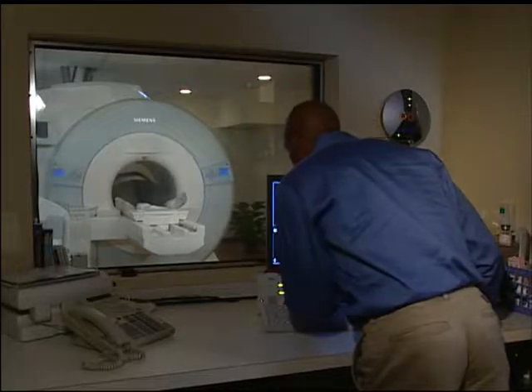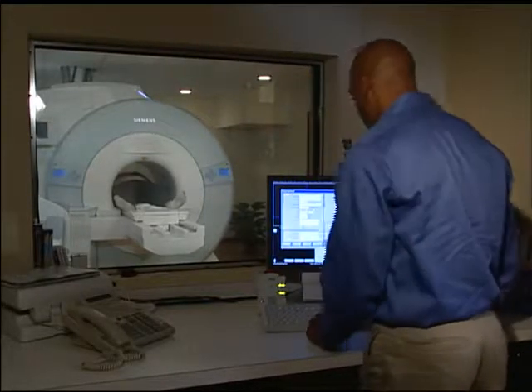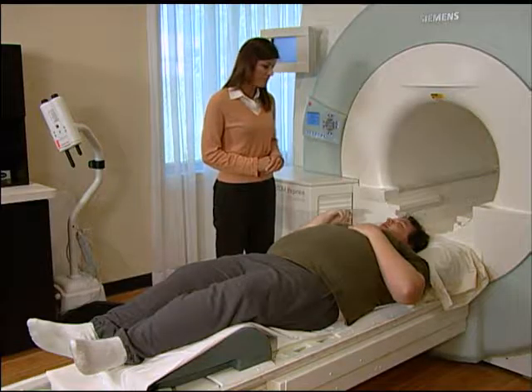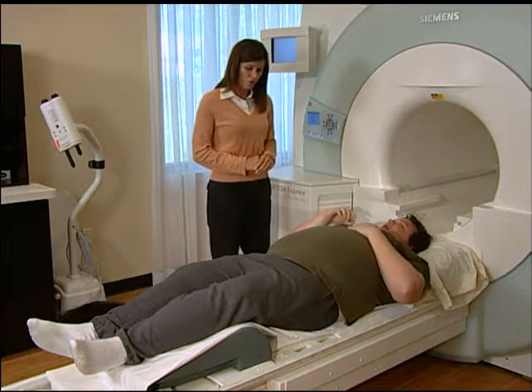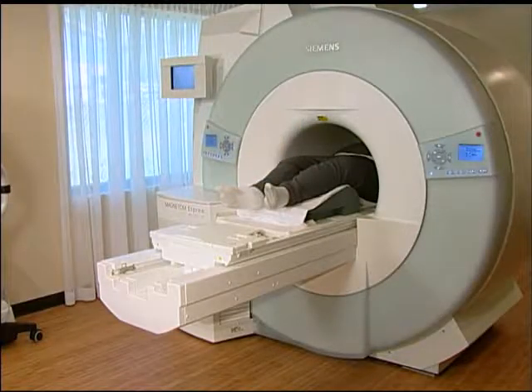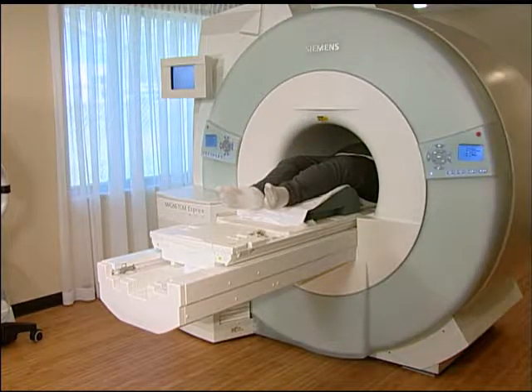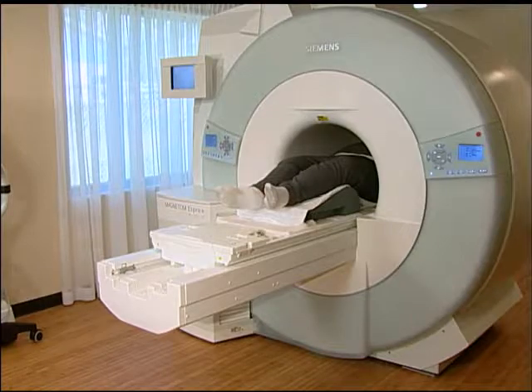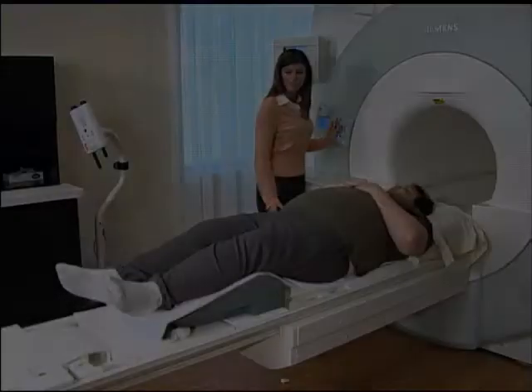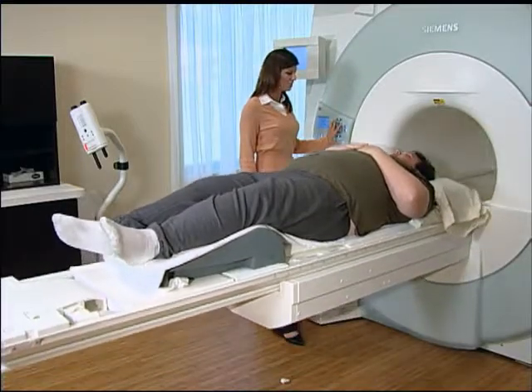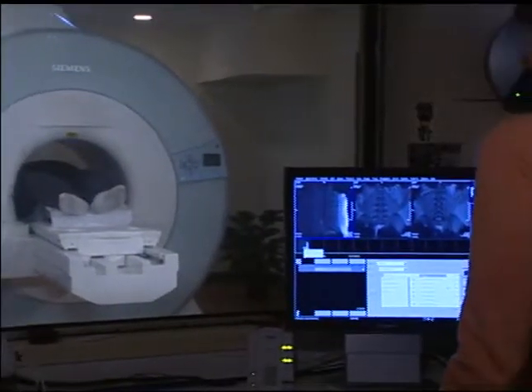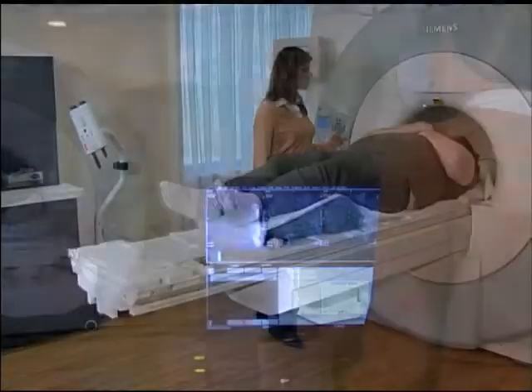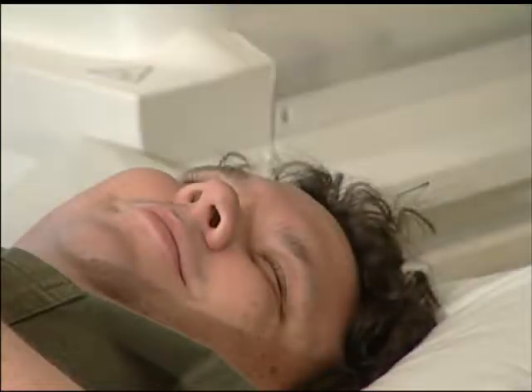How are you doing in there? I'm doing good. It is very important that you remain still while the images are being acquired. You'll know that an image is being acquired when you hear a knocking sound. You may relax when the machine is not making the knocking sound, but you must remain in the initial position unless instructed otherwise. If you move during the procedure, it may be necessary to repeat the exam. Although the MRI exam is painless, it does require you to remain still until the exam is complete.